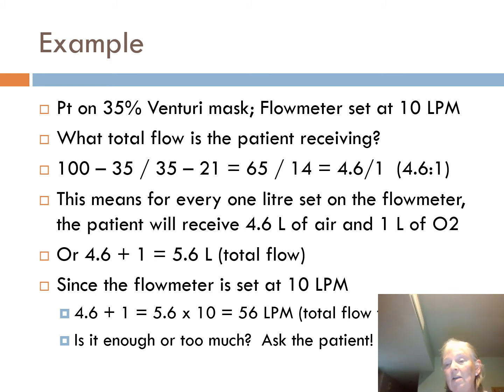And the patient may tell you, man, that feels really, really good. Just leave it alone. Okay, you're good. Or they may tell you, I think my eyes are falling out of my socket. Can you turn it down? Go ahead and turn it down a little bit or titrate it down for that patient.